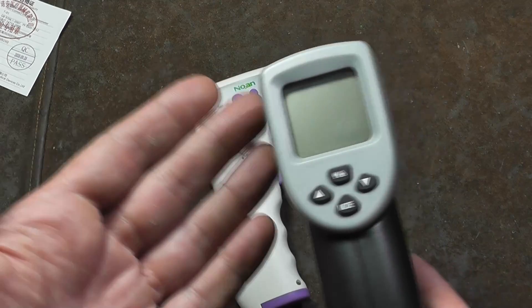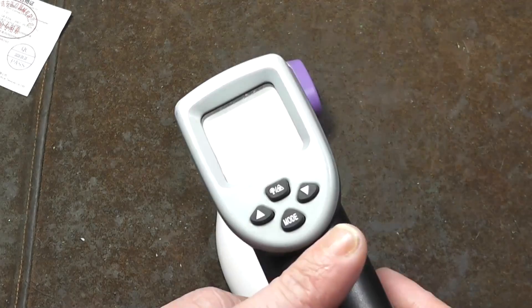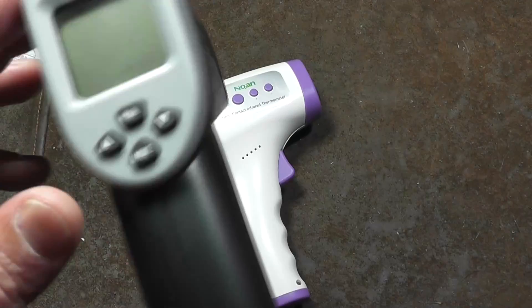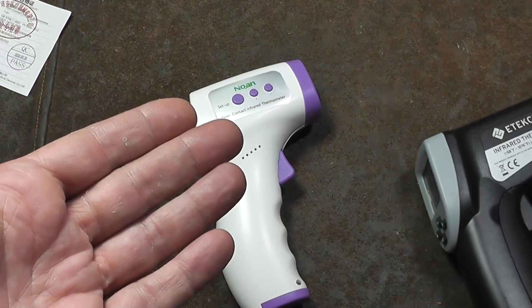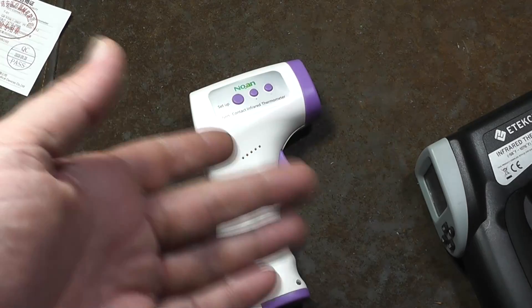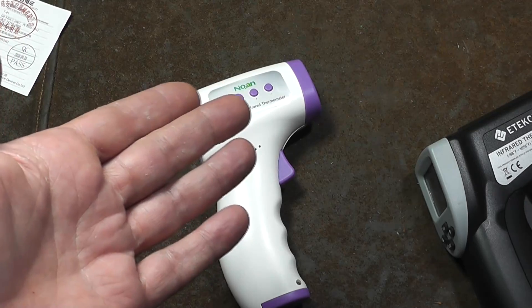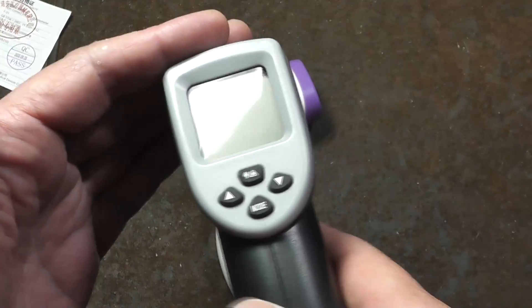People have actually asked several times about the various videos that I've done on these types of heat guns — the reviews. Can I use this on a person? And these are just not designed to be super accurate to detect something like a fever. If the human body is 98.6, say 99.2 might be getting warm and 100 degrees plus, or 101, indicating a fever. You're talking just three degrees there.